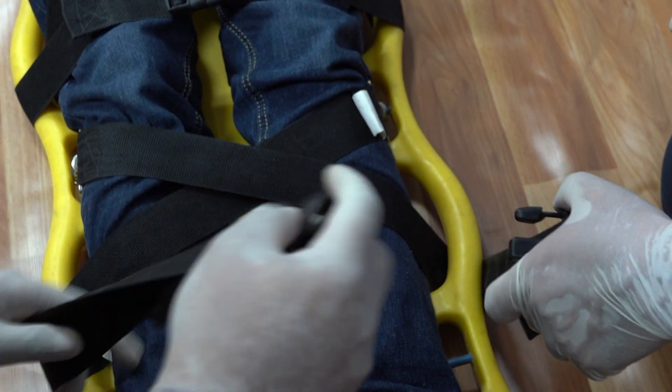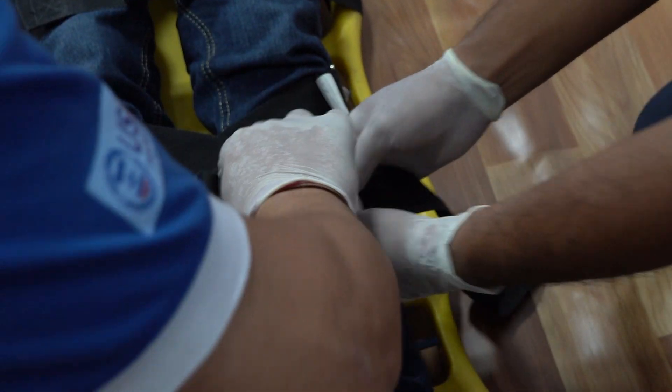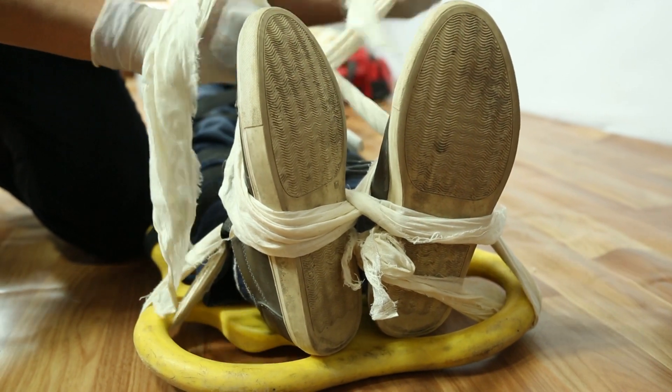Cross the straps and join the male and female ends making a cross. Tie up both feet with cravats using a figure of eight.